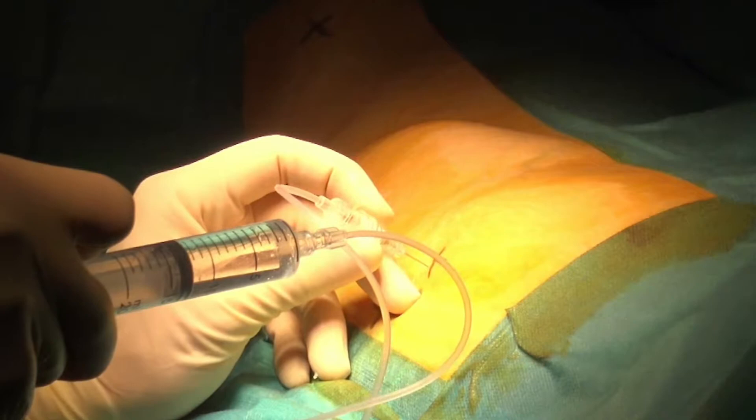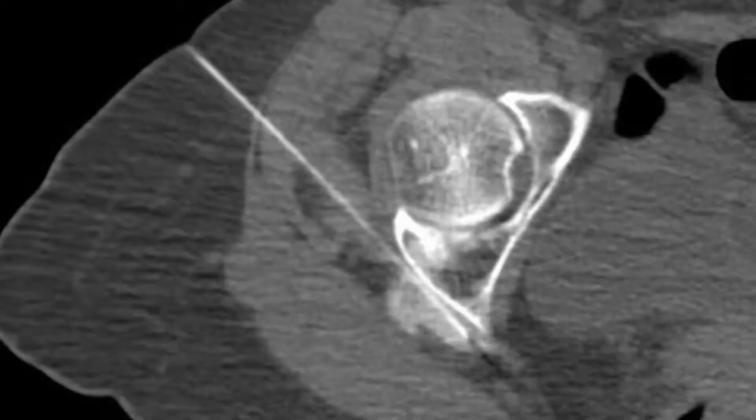To check for the proper distribution of dissection, a mixture of 5% contrast in dextrose is used. The syringe is connected to the spinal needle, which is carefully advanced while maintaining injection. This helps to dissect the nerve away from the posterior cortex of the acetabulum. You can see how nicely the sciatic nerve has been pushed away on the CT control, and note how contrast helps to identify the nerve and assess proper distribution of dissection.